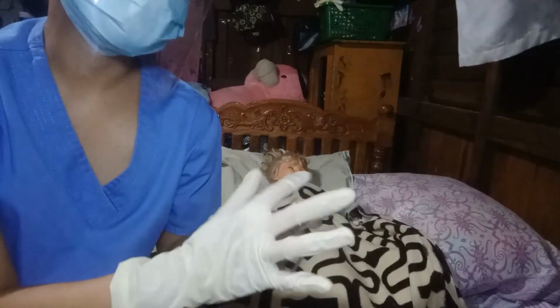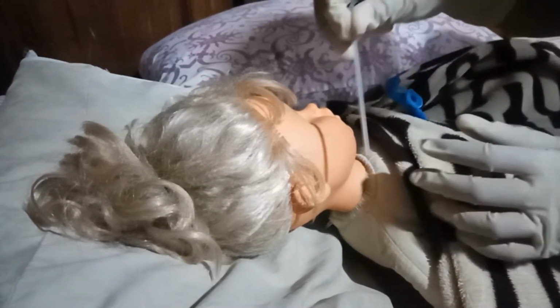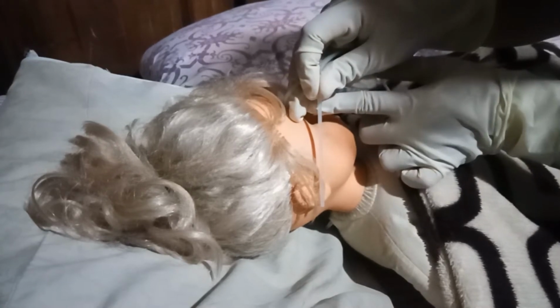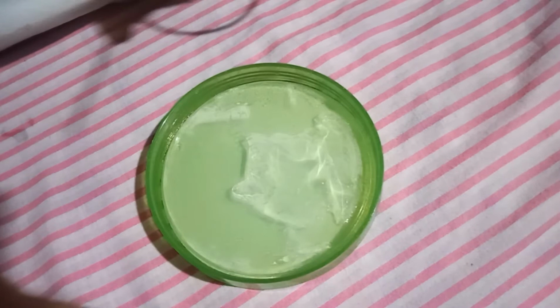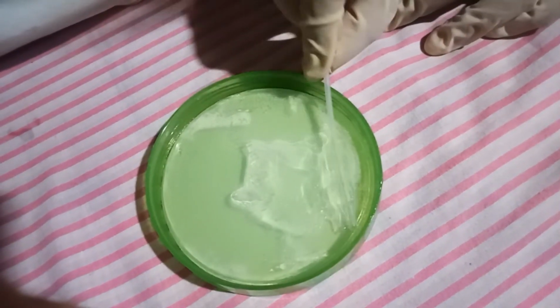We need to maintain the tip clean and sterile. Then we need to do the rule of thumb: the tip from their ear up to here in their face. Next is to lubricate the tip of the catheter.